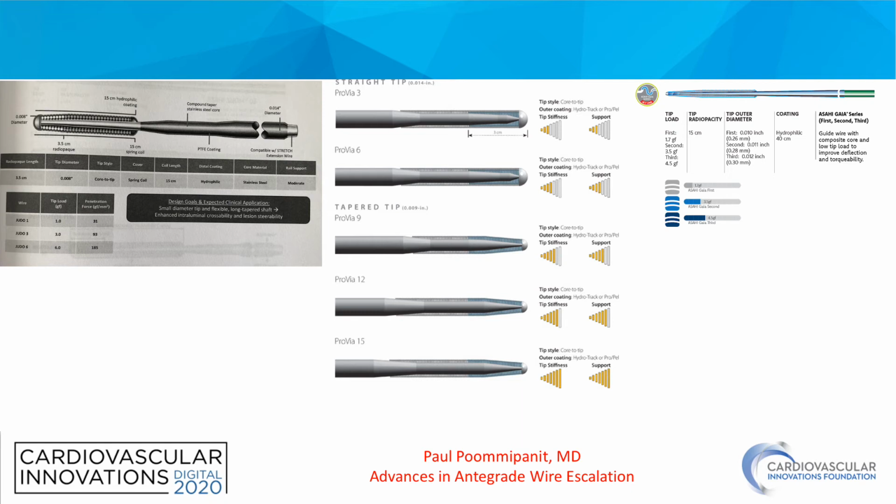I will say in my own practice, I will rarely pull out one of these wires when I know exactly where I'm going and I need a lot of tip control.